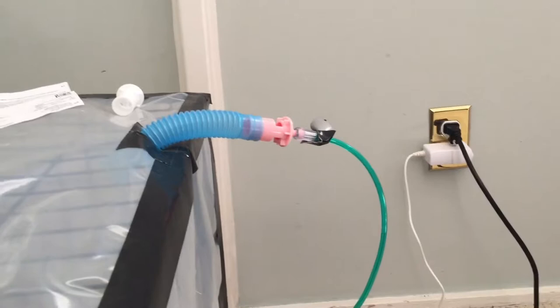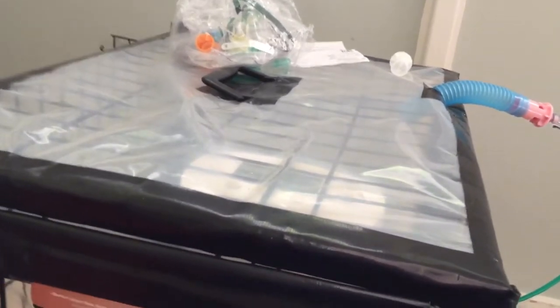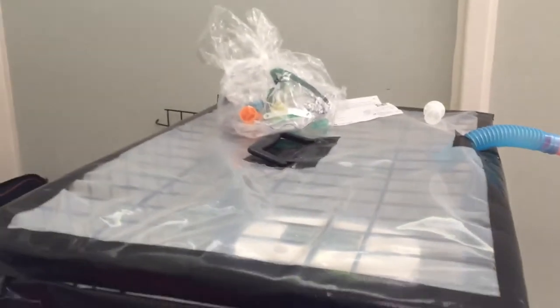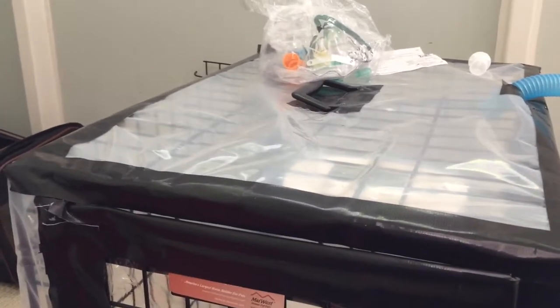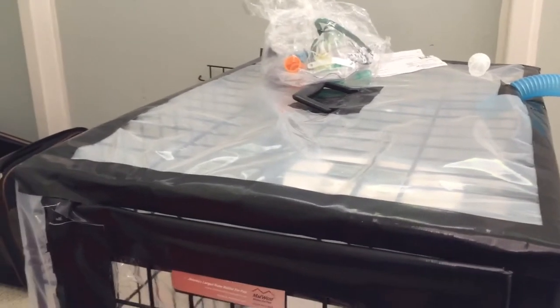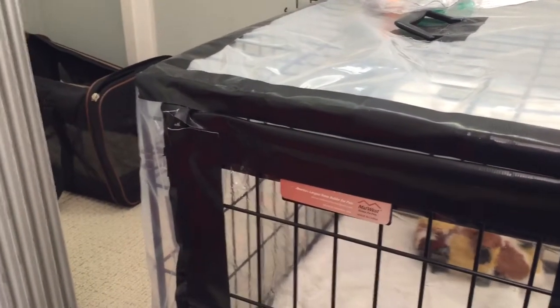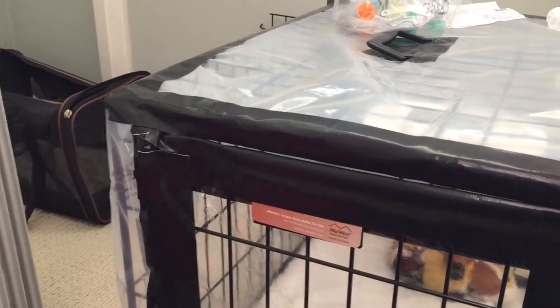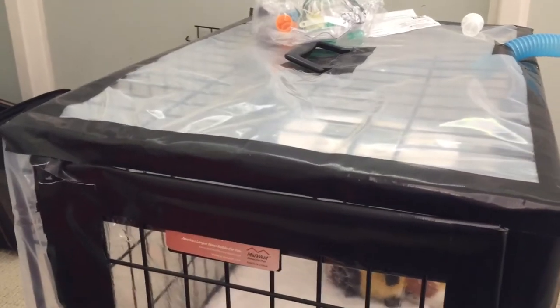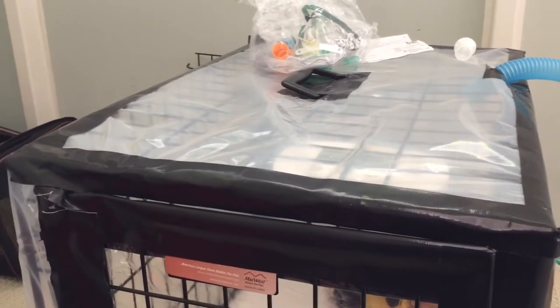I've also used lower-percentage Venturies to experiment with lower carbon dioxide levels. Right now I'm more focused on getting him higher concentrations of oxygen in short periods, because now that he's feeling better he starts barking and wants to get out. The more hyper he gets — breathing hard and barking — the higher the carbon dioxide levels, sometimes reaching 1800–2000 ppm when he's excited. When he's just chilling it might be around 1000–1200. I did have lower CO2 levels with a 31% oxygen mixture, but I figured it was safe to bump him up to 40%.